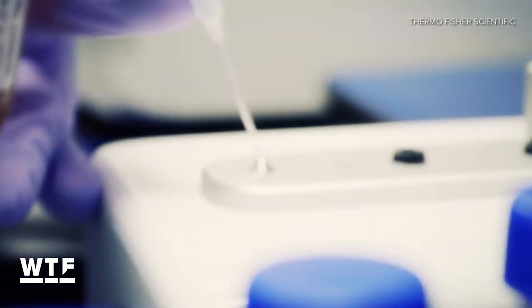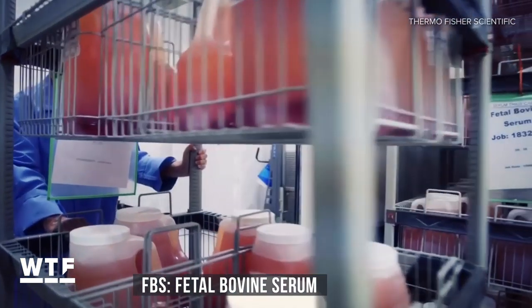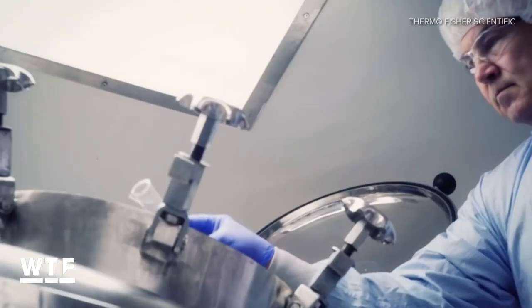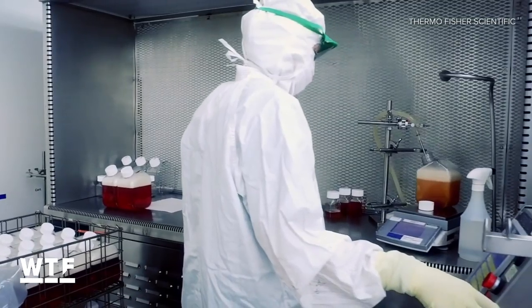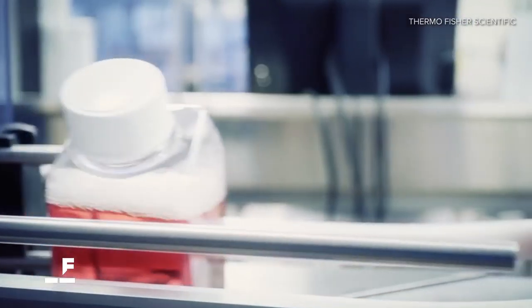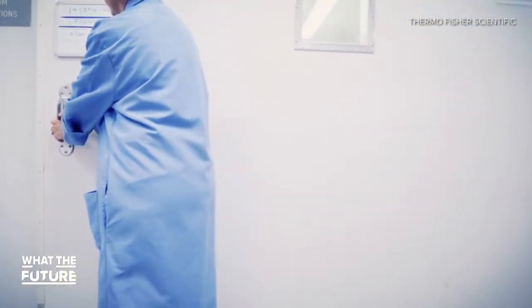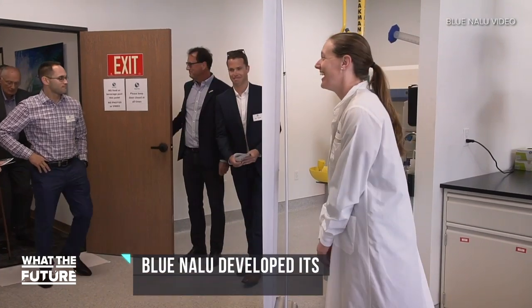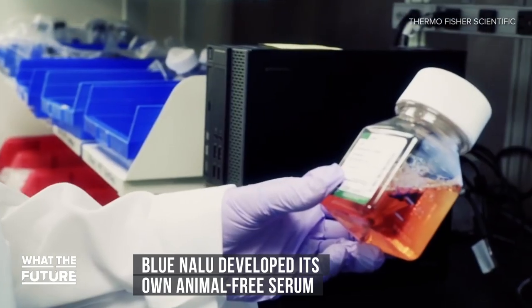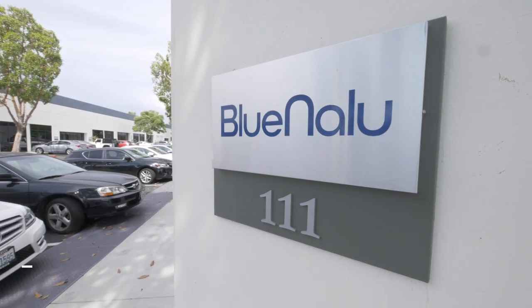Most labs that grow cells use a growth medium called FBS — Fetal Bovine Serum — which is made from the blood of unborn calves. This nutrient-rich solution has everything cells need to grow, but it isn't the kind of surf and turf that purveyors of sustainable seafood want to be associated with. That's why Blue Nalu has developed its own animal-free serum by replacing the key components of FBS with plant-based alternatives. At Blue Nalu, the fish cells eat vegetarian.